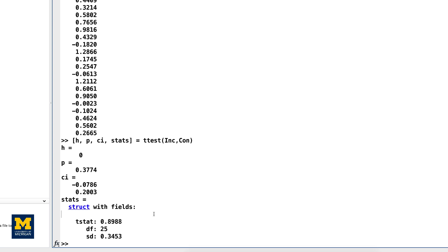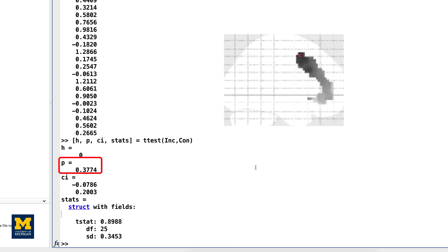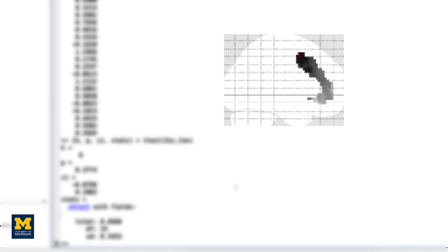You may have noticed that the results from the ROI analysis using the anatomical mask were not significant. This may be because the ACC mask we created covers a very large region. Although the ACC is labeled as a single anatomical region, we may be extracting data from several distinct functional areas. Consequently, this may not be the best ROI approach to take.